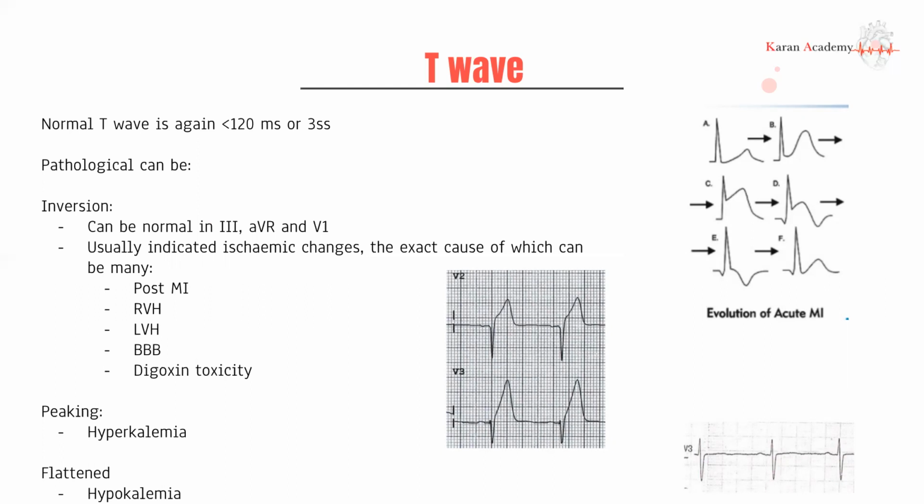I can go into the pathophysiology of why you get the inversions, because there is a movement of potassium ions out of the cell as the cells are dying, typically causing firstly a T wave peak and a T wave inversion afterwards. But I think that's just too high for your level. You need to know that hyperkalemia can present with peaked T waves, and hypokalemia presents with flattened T waves. Typically, when we have an acute MI, in most cases, first you get the peaked T wave before you get the inversion. Why?